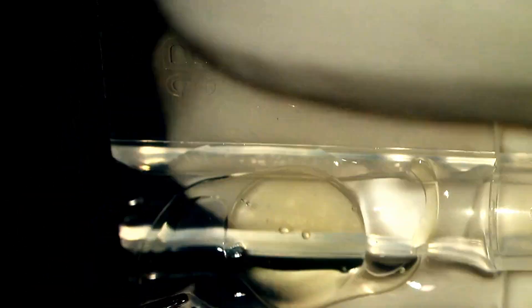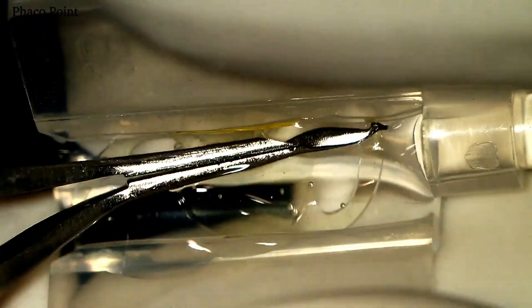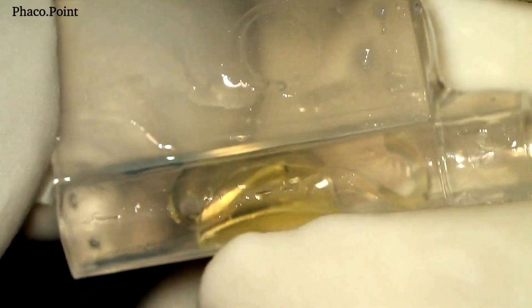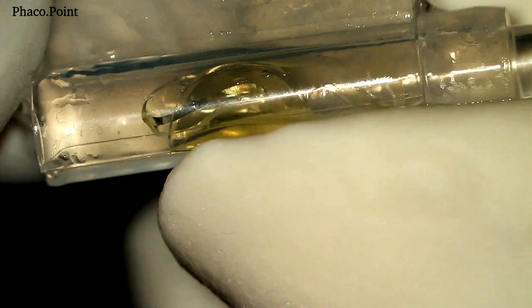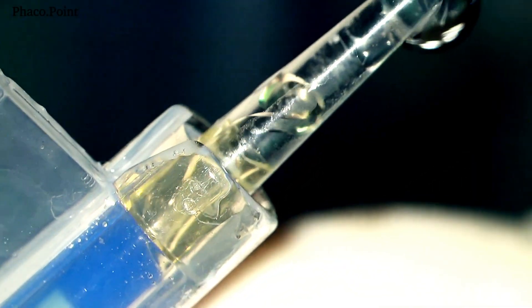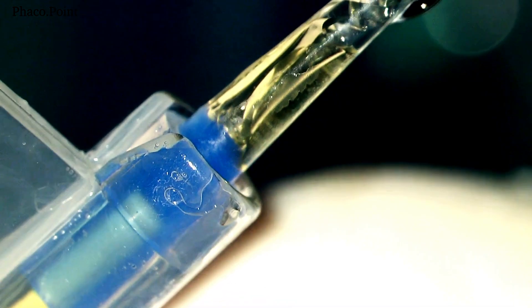Loading of these toric IOLs is no different from any other foldable IOL. Once the optic edges are pressed down firmly in the cartridge, I take the trailing haptic, place it over the optic, and then clasp the cartridge shut. I then confirm the optimal position of the IOL within the cartridge. The cartridge loaded with the IOL is now snapped in its position within the injector. Then, under direct visualisation, the injector pushes the IOL up to the anterior aspect, close to the tip of the cartridge.